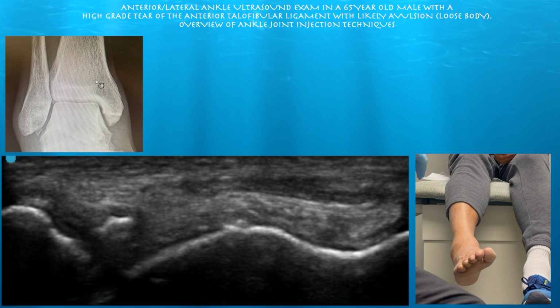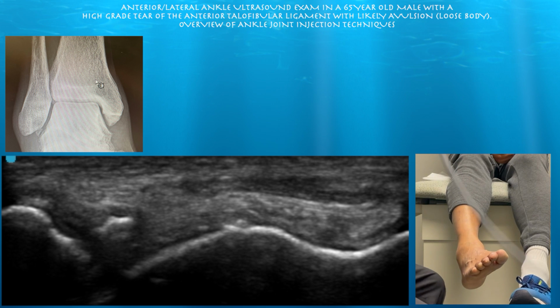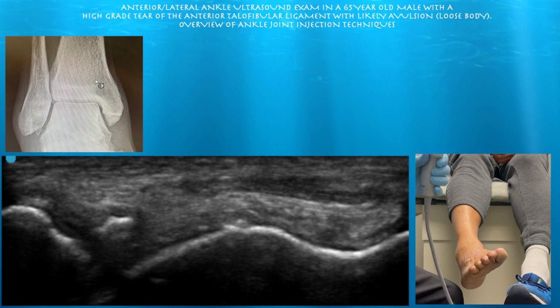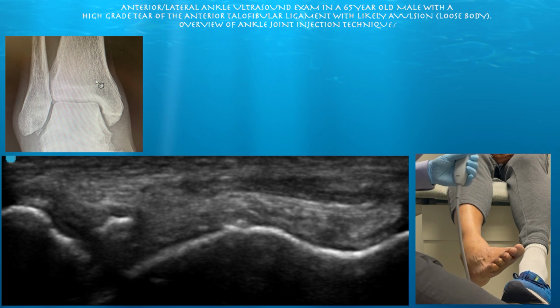This x-ray does show some loose body within the lateral ankle mortise. I'm not sure if it's actually within the joint. It looks a little bit low to be in the joint, so it might be just within the soft tissue. So we're just going to go ahead and do an ultrasound.